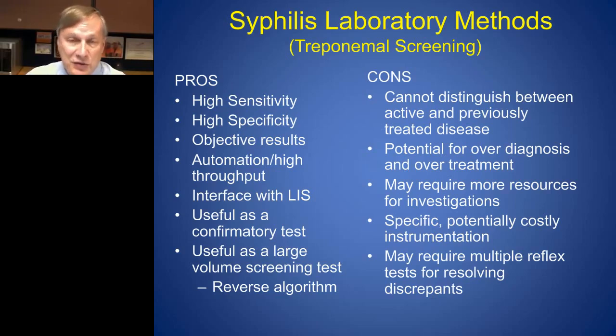Now, some manufacturers, again, reagent rentals, and you add a few pennies to a nickel to a dime to the test, and you have the instruments. So these are things to look at and just things to be aware of when you determine the cost and how and what you're going to use to screen for syphilis. They also might require multiple reflex tests for resolving discrepancies. If we're talking, again, the reverse algorithm, and we'll go into more detail on that in just a few minutes.